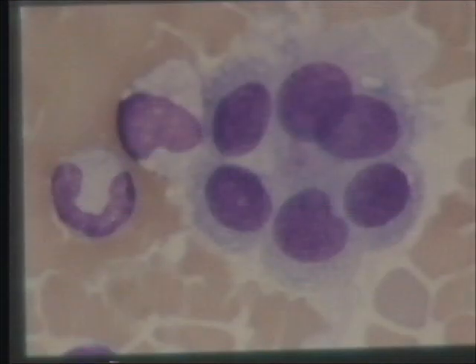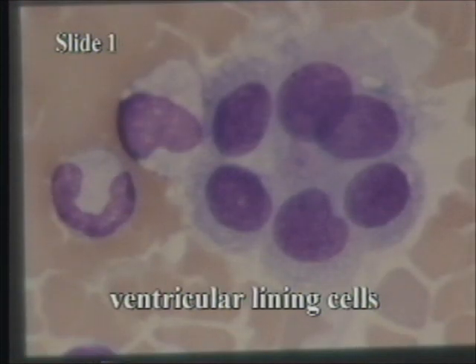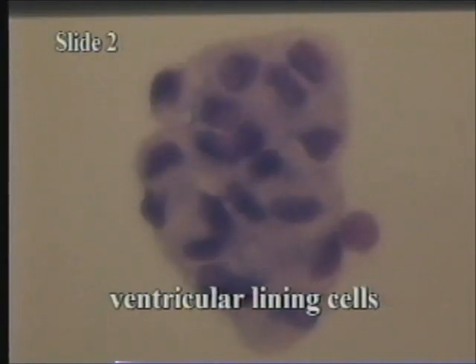We're going to look at microscopic findings that are either specific for a particular fluid or are of diagnostic importance. We won't be covering the normal hematopoietic blood cells, and we'll start with CSF. One type of cell that you may see on rare occasions, specifically in cerebrospinal fluid, are ventricular lining cells. Other terms used for these cells are choroidal, ependymal or neuroectodermal cells. It is not important to be able to put an exact name on them. What is important is that you recognize them as ventricular lining cells, which are not diagnostically important, and don't confuse them with clusters of malignant cells.